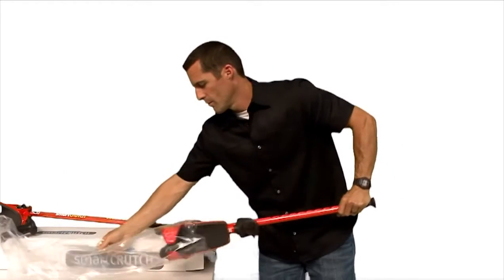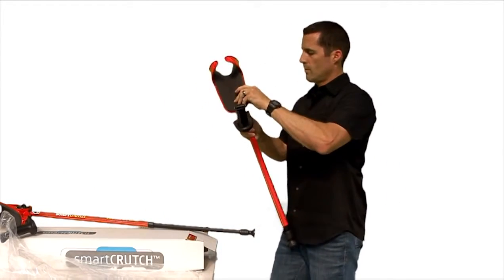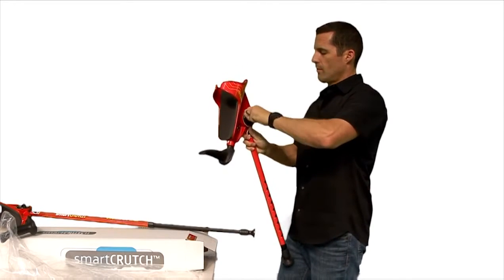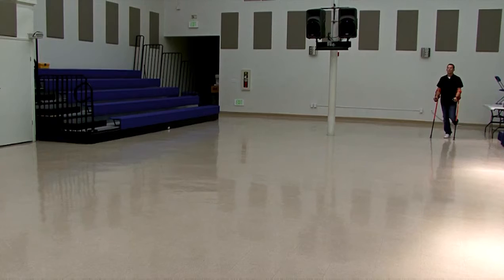Once you have the settings in place with the right side, go ahead and adjust the left crutch with the same settings. Once you have the other crutch set, you are now ready to take smartCRUTCH for a test drive.